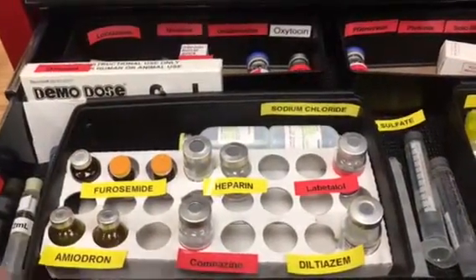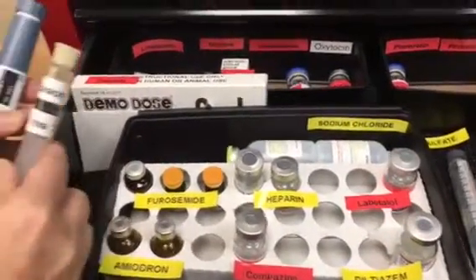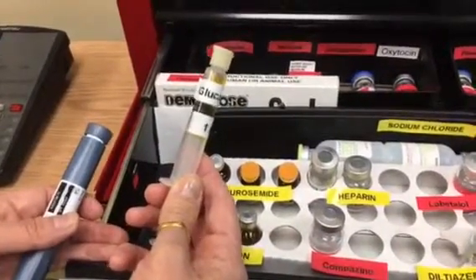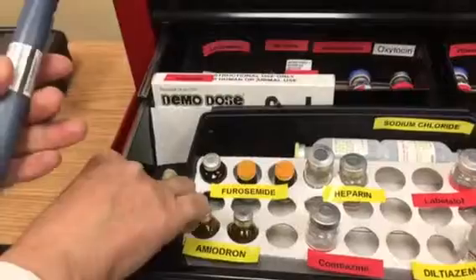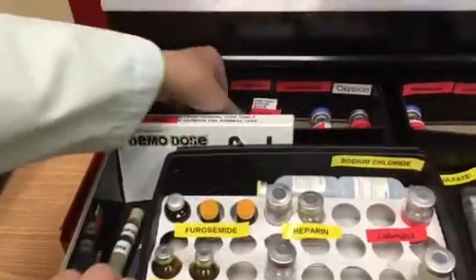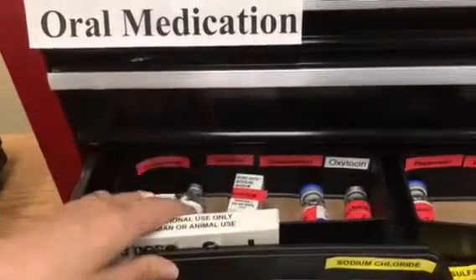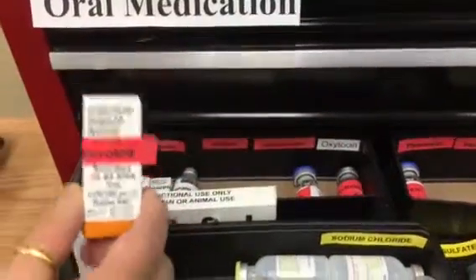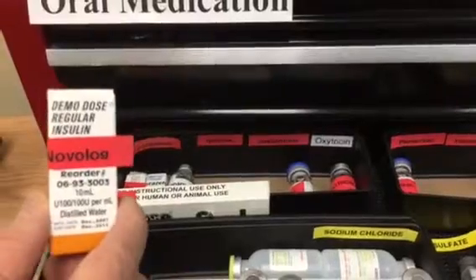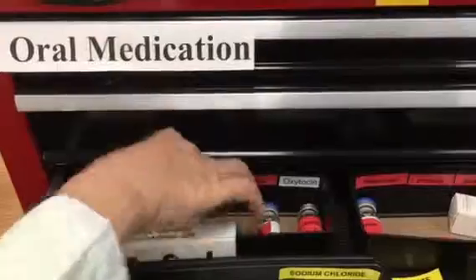Very important also, we put two medications on the side here that do not have a label yet. The one will be your glucagon. For PN students, you also will use it as well. And also insulin, the pen. And then also your insulin, you can either, sorry, not this one. For this one, you can use it for the sub-Q. For RN students, you oftentimes may use it as the regular insulin for the IV infusions.